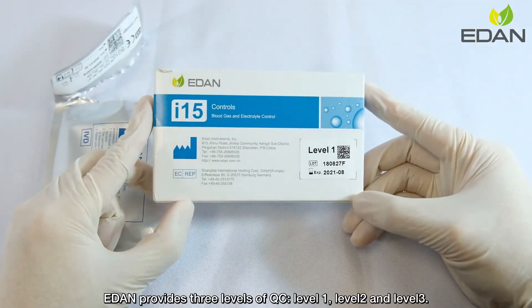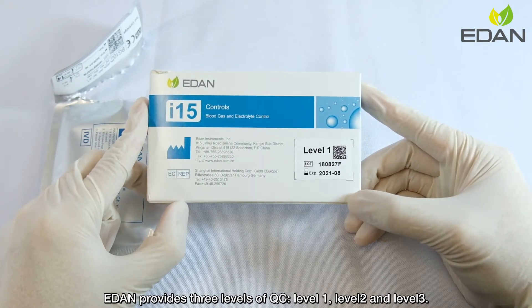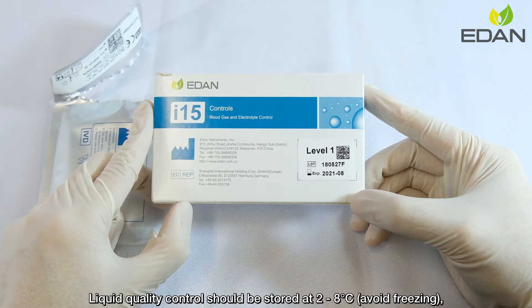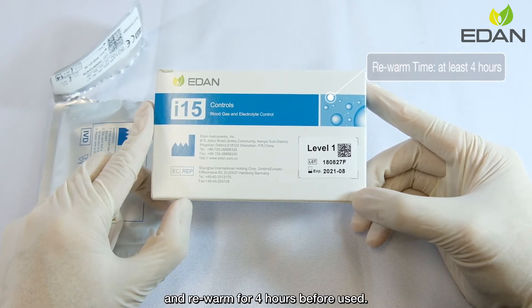Eden provides 3 levels of QC: Level 1, Level 2, and Level 3. Liquid quality control should be stored at 2 to 8 degrees Celsius, avoid freezing, and rewarmed for at least 4 hours before use.